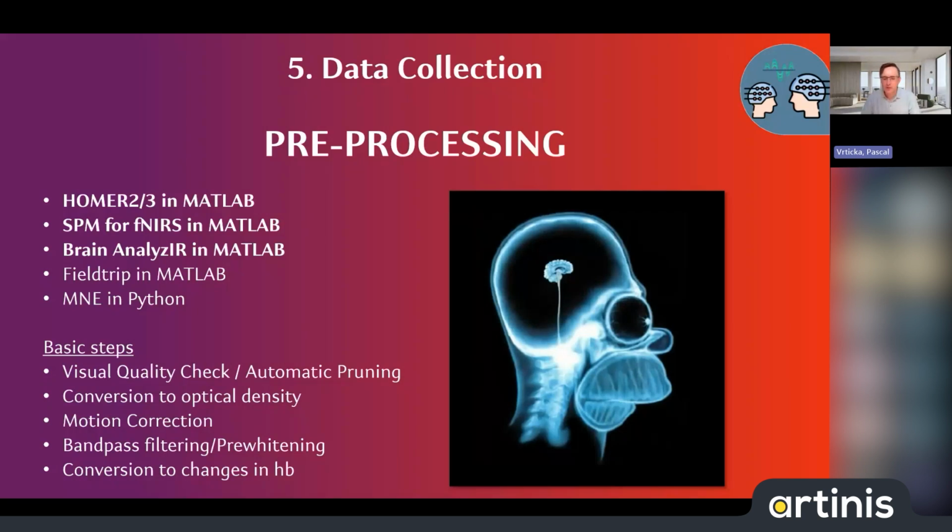We like to use these MATLAB scripts because each pre-processing step has a separate little script where we can also play around with the parameters, so we know exactly what goes in and why we get a certain result, which is sometimes not as intuitive. And also you can, of course, do everything step by step and actually see what happens to your data.